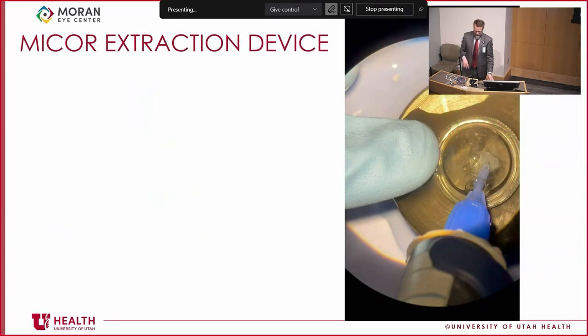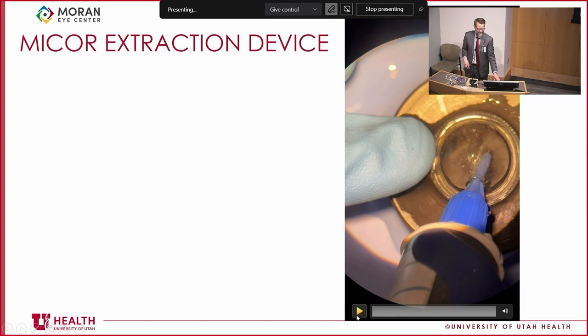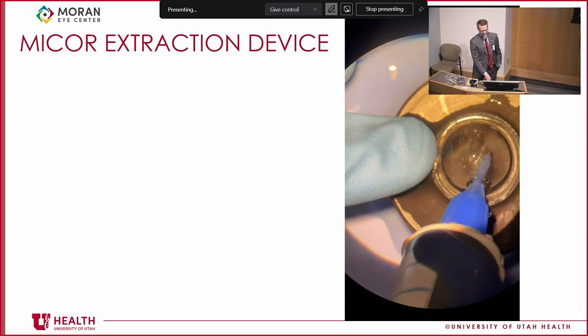One thing that is slightly different with this device is the sound, if you're able to hear this online. As that motor is spinning and you've got those cams clicking, it clicks. As I remember, this is sitting at around 44 hertz, whereas ultrasound is sitting around 44,000. Correct, 44 kilohertz. So you're exactly right. You're talking 1,000 times different.